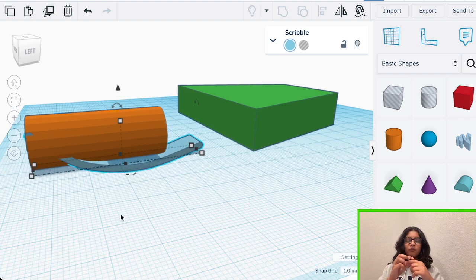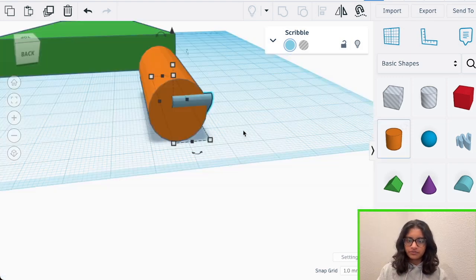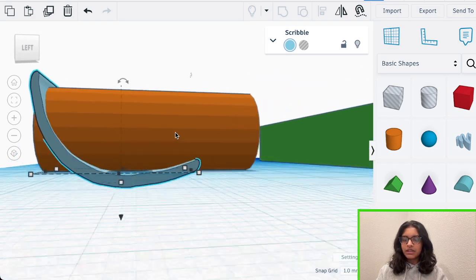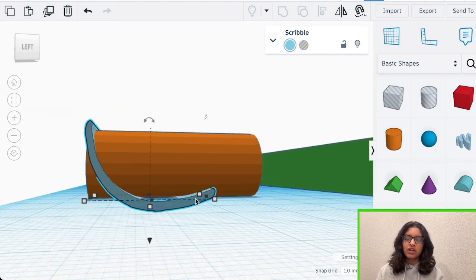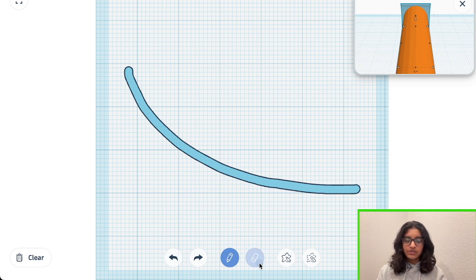And since this is the whole first joint of your finger, the cylinder, you're going to need to change the sizing of your curve until it actually looks like a finger appendage. Just keep adjusting your curve size until it looks like almost a carved out, drawn version of your finger from the side. You also might need to adjust parts of your curve after you've already moved them around your finger. So for example, for me, there's this extra curve upwards that will just cut into the finger later on and not look super natural. So I'm just going to erase that by double clicking on my scribble curve and just erasing the last part of it.